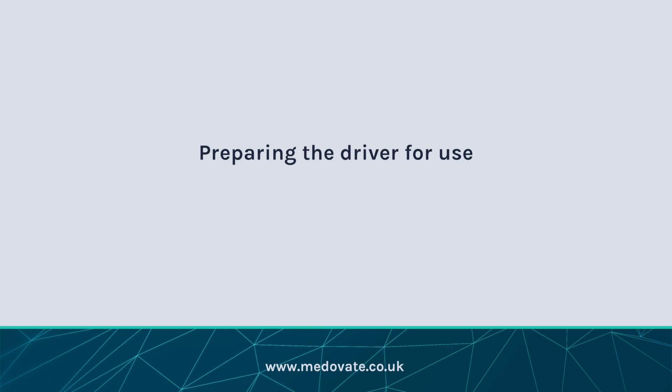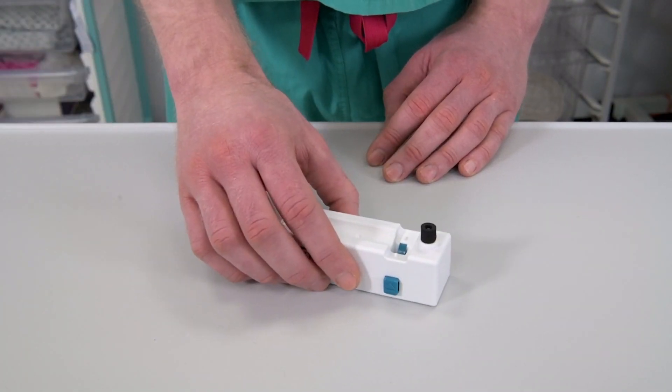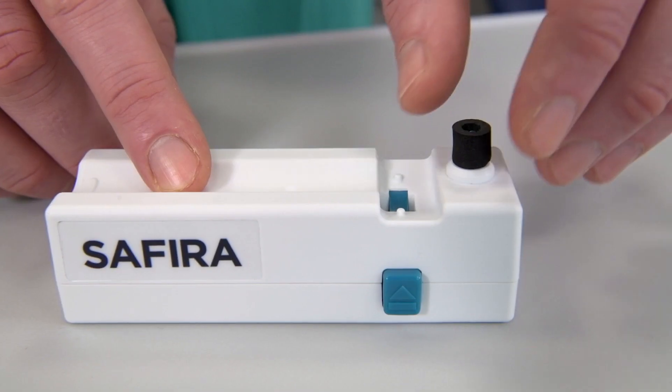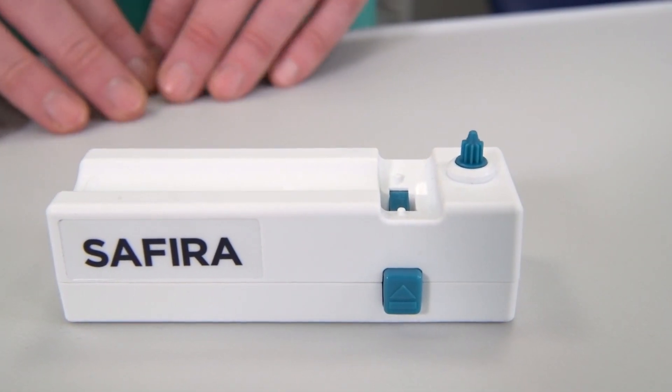Preparing the driver for use. The Sephira driver is fitted with a protective foam black cap on the driver gear. This needs to be removed when the driver unit is unpacked for the first time. There is no requirement to retain this black cap.